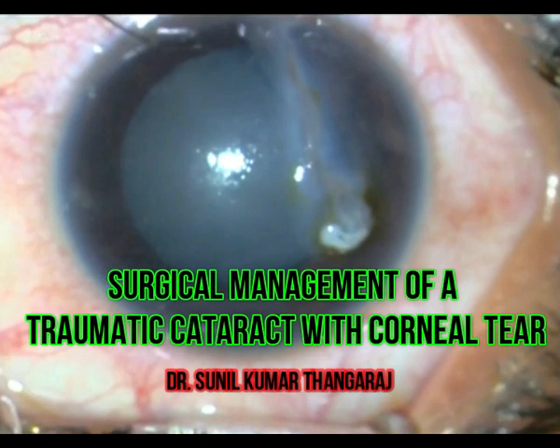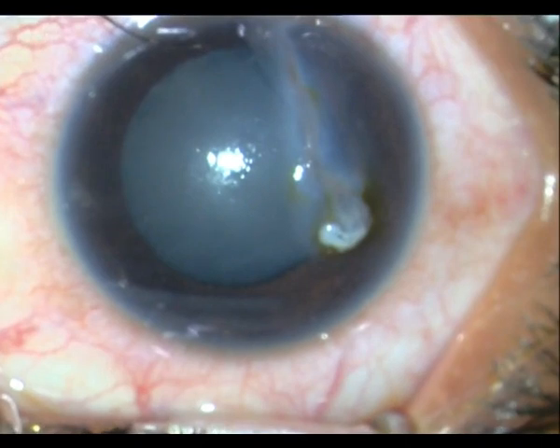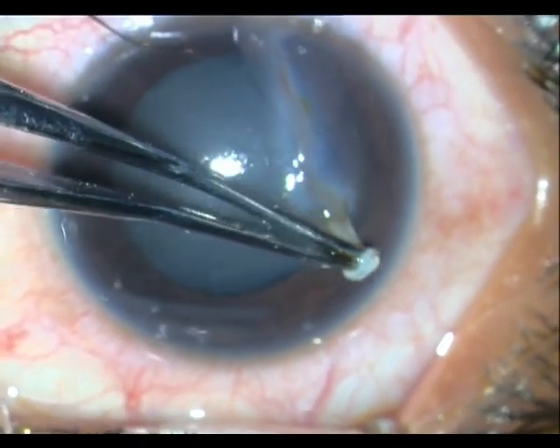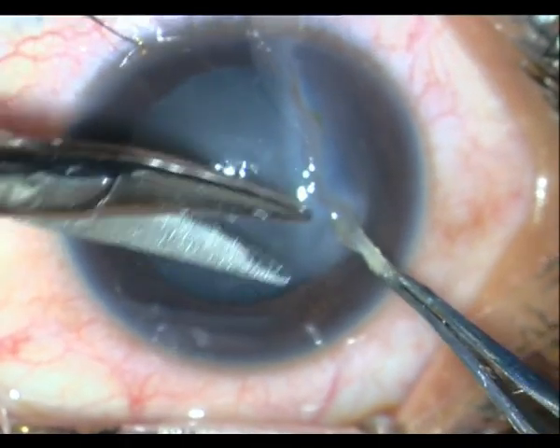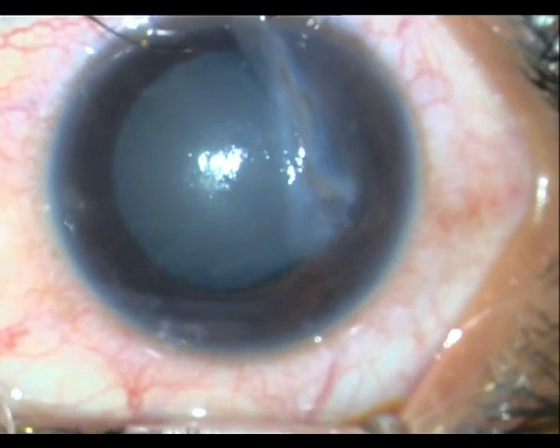This is a case of penetrating trauma due to a sickle, and this patient was referred to me almost a week later. As you can see, there is a large wound with some debris over it, as well as a traumatic cataract.